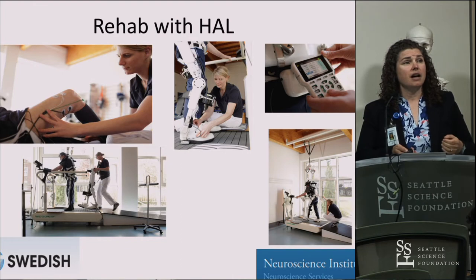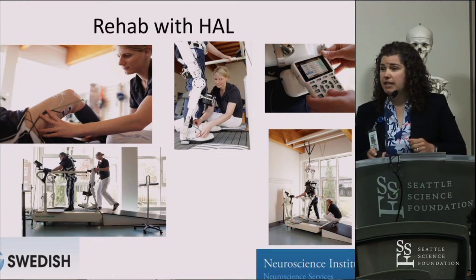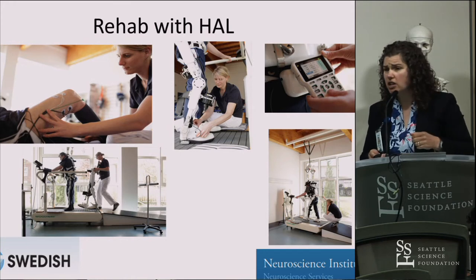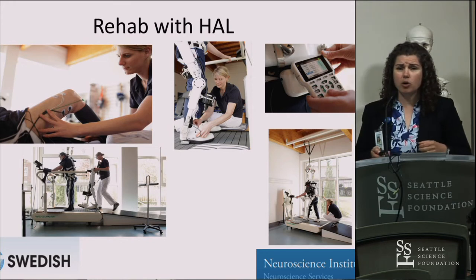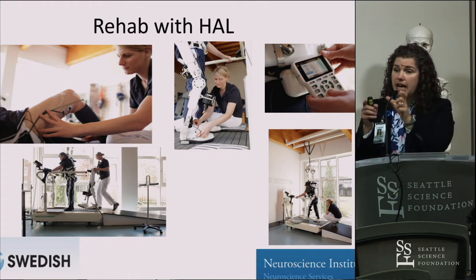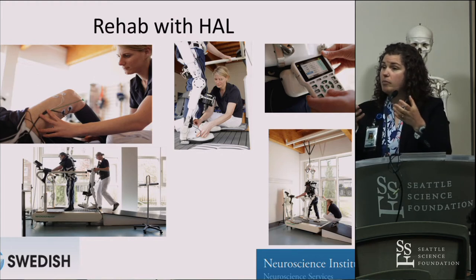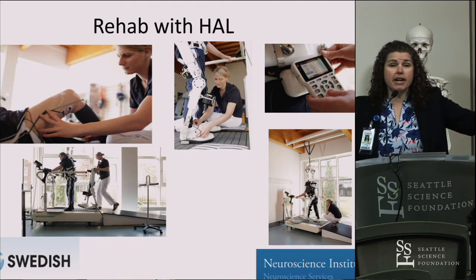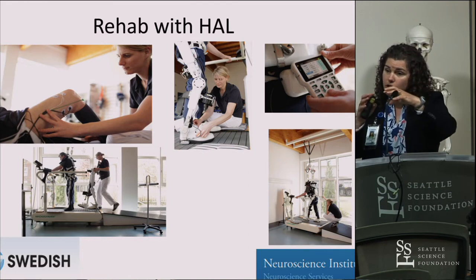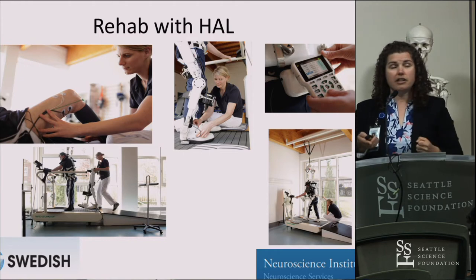One of the things that I had the opportunity to do that they haven't been doing in Bochum yet, and they have some anecdotal evidence may be effective in Japan, is I had the opportunity, we enrolled a patient that was much weaker than patients that they see typically in Bochum, and I had the opportunity to use the HAL as a biofeedback unit. We have a really nice screen that shows the patient what muscles they're contracting and how much. And as you probably know, a weak patient will bring in every muscle to try to do an action. And they can see what muscles they're contracting and try to learn to focus and individualize the contraction and create a bigger contraction on that single muscle.